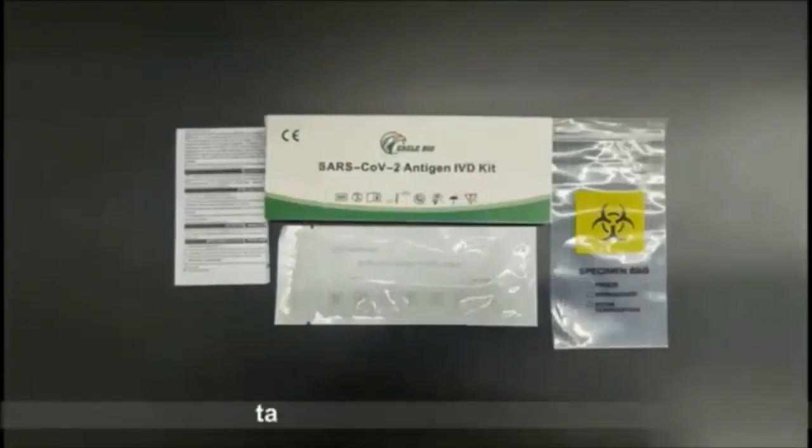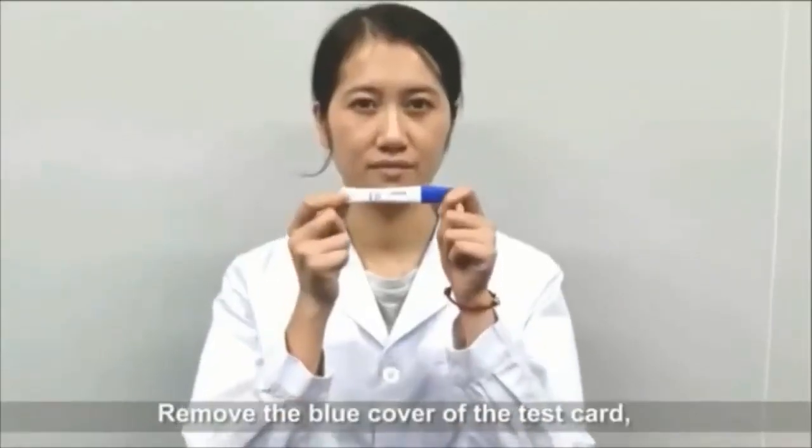After the test card returns to room temperature, take out the test card. Remove the blue cover of the test card.